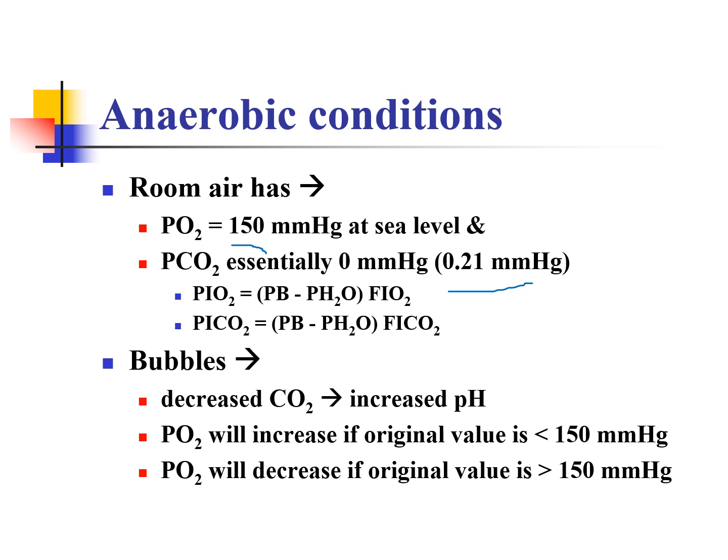Because of their CO2 decreasing, what do you think will happen with the pH? Well, because the CO2 is decreasing, the pH will go more alkalotic as well, right? Less carbon in there means it's going to be less acidotic. So the whole blood gas will be inaccurate, and we may make poor clinical decisions based upon that inaccurate blood gas. So you need to make sure it's good.